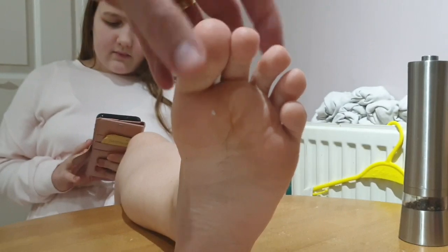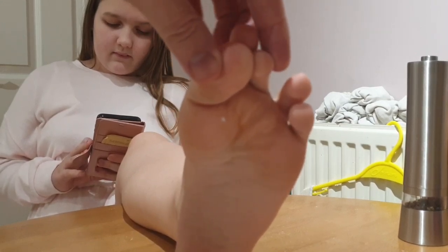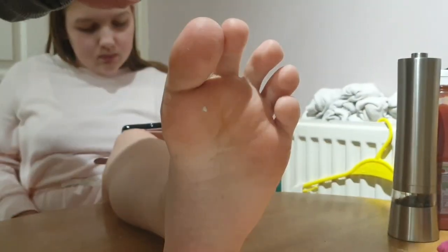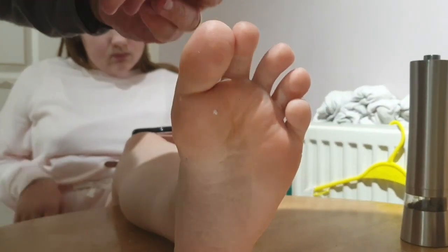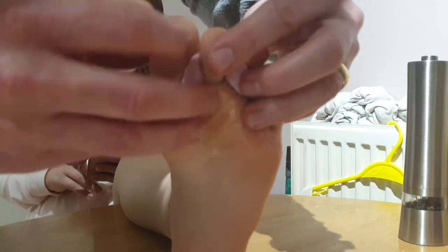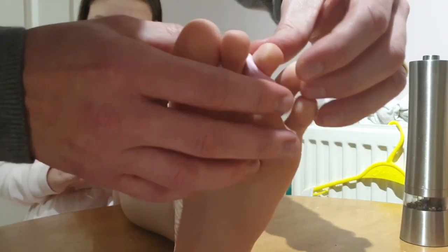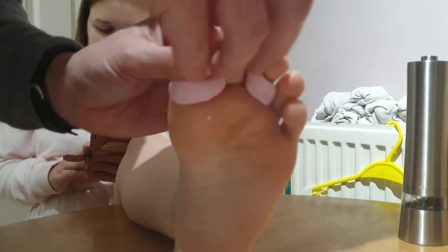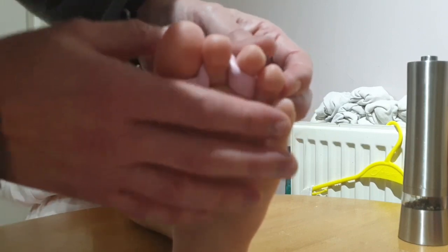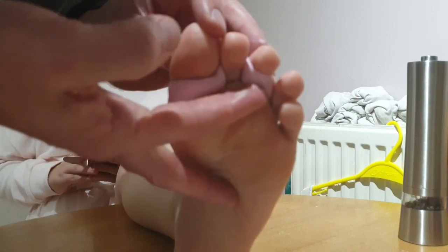There are two ways we can do it: one is to push down on it from the top, and the other is to keep those two toes apart so there's a slot for it. Pressure from the shoe will push it into the slot made for it rather than pushing it onto the other toe. Once again we have molded our nice homogenous blob. This one is going to be sausage-shaped and we're going to go under that toe, over that toe, and under the big toe — you want it to be quite thin there as it can cause irritation. You'd make this with the toe plantarflexed.